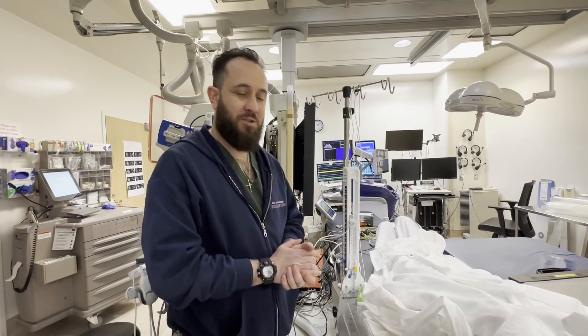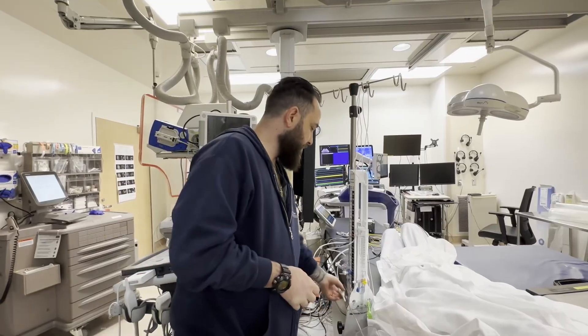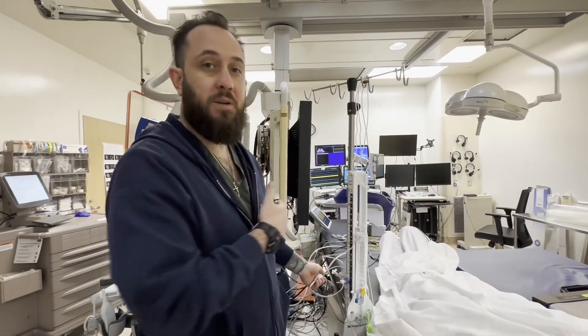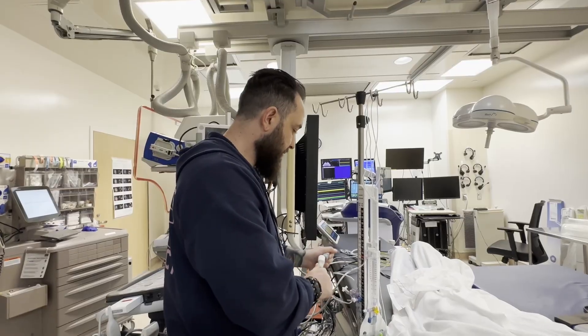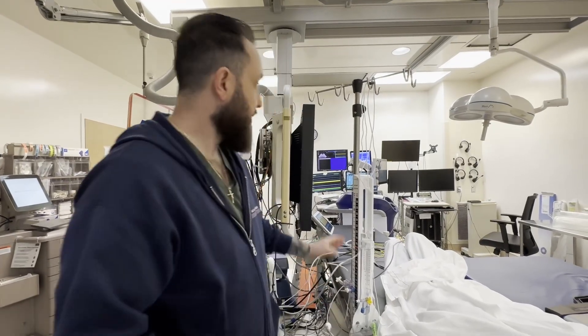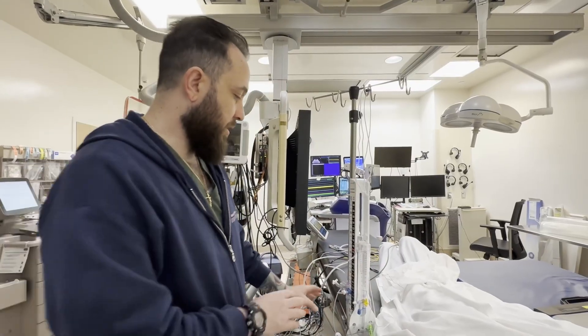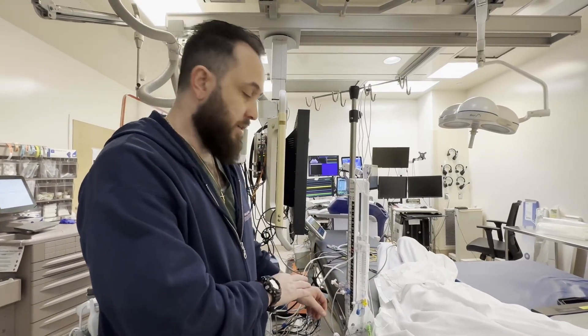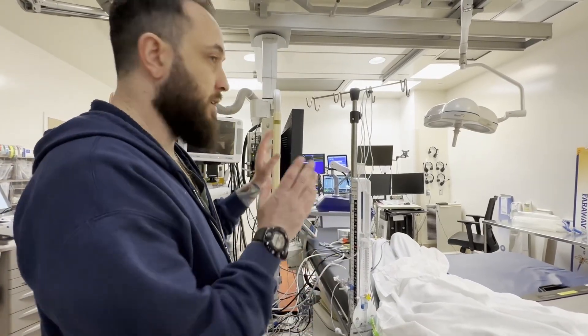Now we're going to talk about troubleshooting. A couple things that could happen: the waveform has been dampened or the cable has been disconnected. You'd want to make sure it's connected, then re-zero to confirm it's a true waveform and true ICP. Maybe there was a big increase or change in ICP — in that case, just go through the zeroing process again.